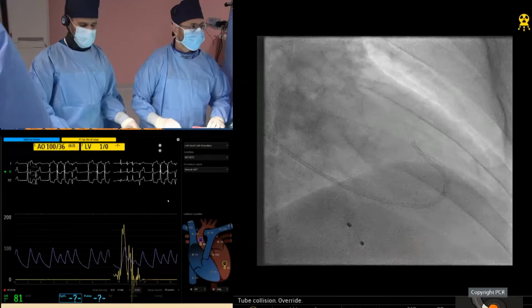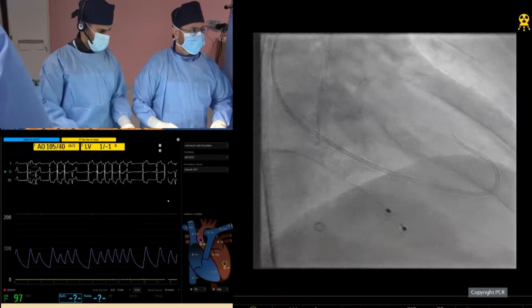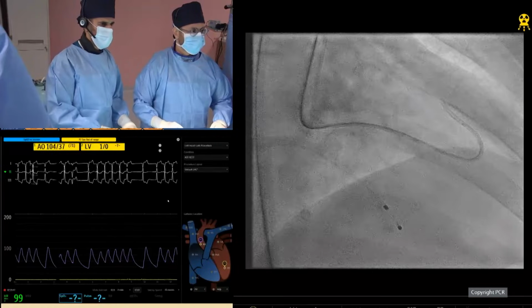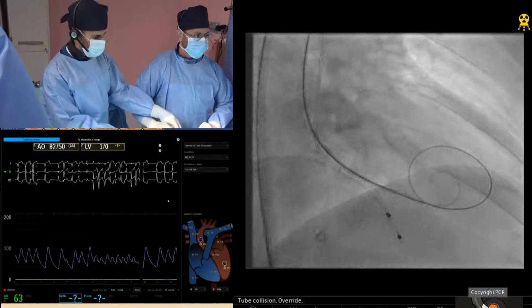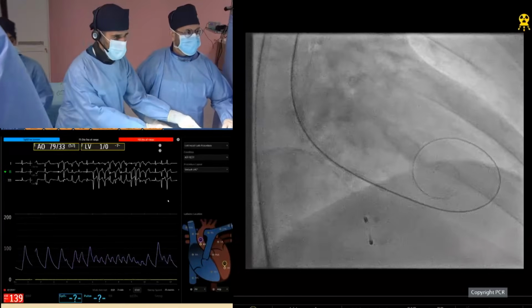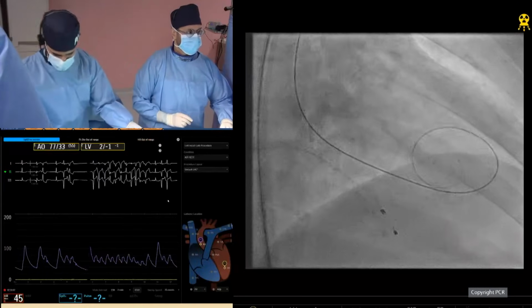Hatem, what size of the Safari wire are you using? We're using the Safari small. So is that your choice normally, and how do you decide? Is that your usual wire to use? Is there specifically any anatomy that you'd like to use extra small Safaris? Because yes, a lot of Asia uses extra small rather than small Safaris. So do tell us a bit more about why.